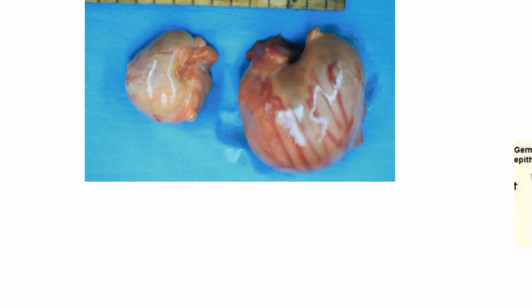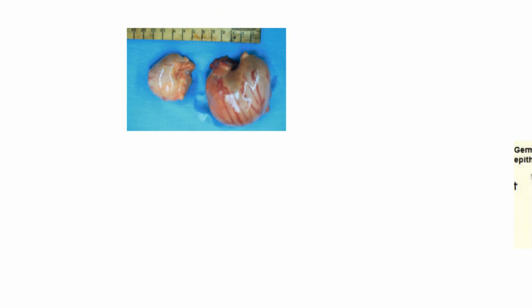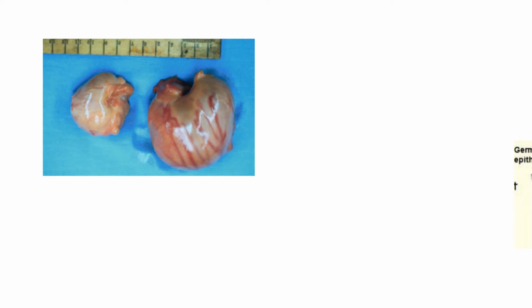And then, of course, I can't forget one of our focus animals. We did dog and cat just previously here, but I want to talk about a horse. Ovaries, and of course they're going to be bigger, and this is a little fuzzy picture, but if you look at that scale up on top, this is in centimeters, and from this point here to 2.5 centimeters is an inch. So this ovary is 2, 3, 4 inches across, way bigger than the dog or cat, of course, and well, not maybe of course.